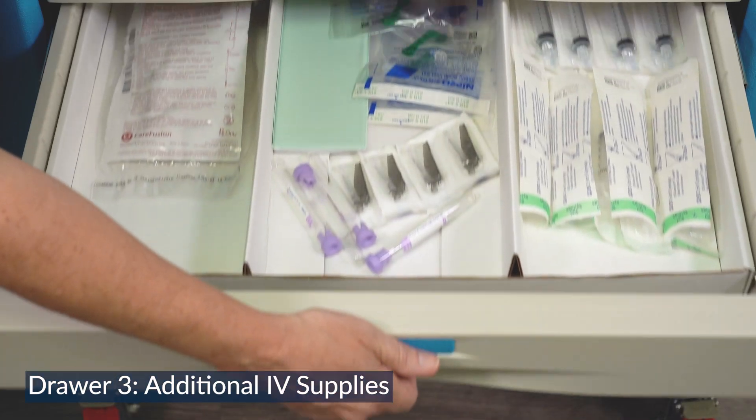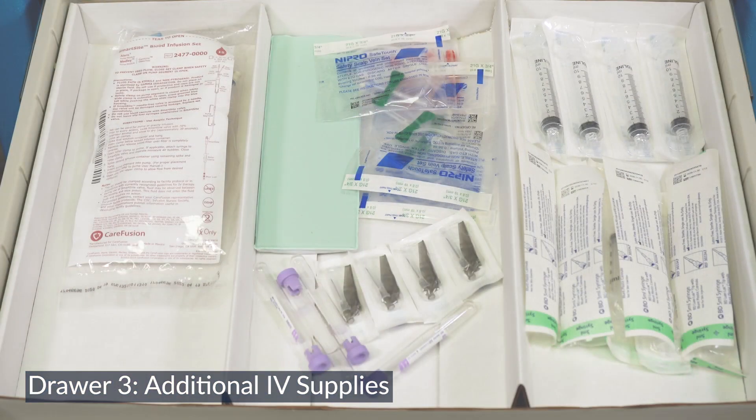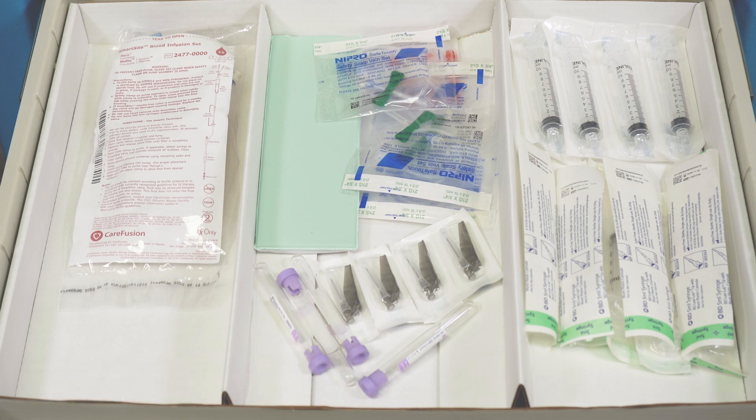The third drawer has supplies to administer IM medications and draw blood for lab testing. Blunt filter needles are ready to draw simulated carboprost and methergine. Y-type blood tubing is included in case a blood transfusion is required.